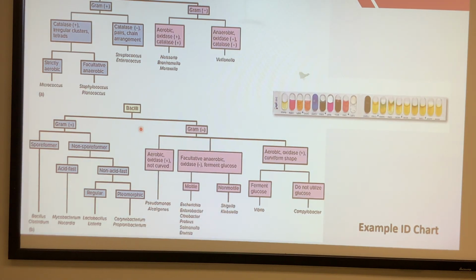So how do you do that? If you do every single one by hand, it takes forever, okay? There's no way you can finish your patients with nowadays' laboratory volume. So they do have commercialized little test kits.